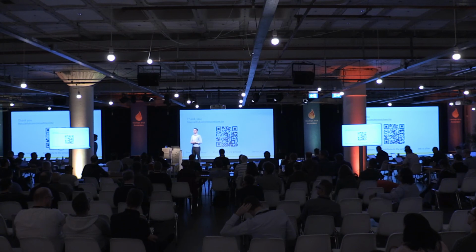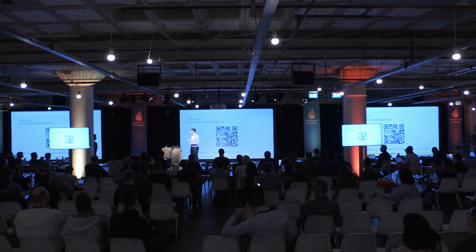So the question is, during that 1 hour, is all that cached in the connector pipeline? No. The hour observation time is separate from the caching or the buffering time. So you can set it to be, say, 5 minutes. That's how often data is going to be flushed into FHIR. So essentially, in the demo that I have up here, I have the buffer set for 30 seconds. So every 30 seconds, the data is collected, and then it's flushed and appended into the FHIR observation.